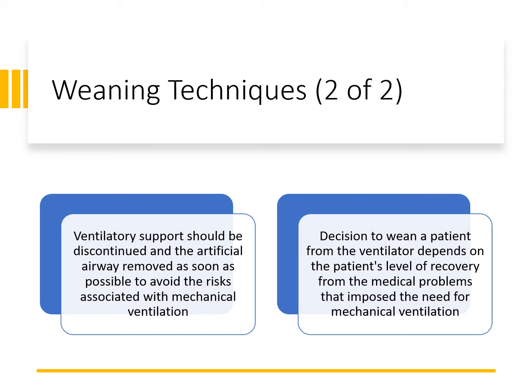But taking someone off too early could also lead to issues where they could have a higher mortality rate as well. So it's a fine balance between, is a patient good enough to wean to extubate, or should we still leave them on and let some more muscle recovery happen, right? Or more, whatever caused them to be on the ventilator reversed.